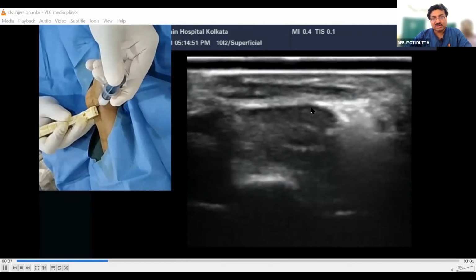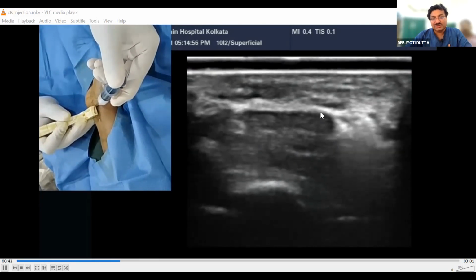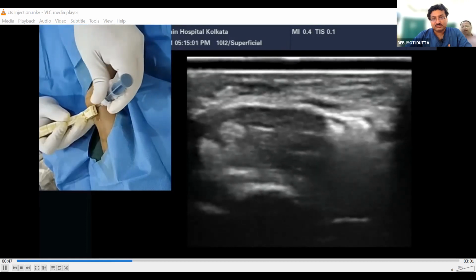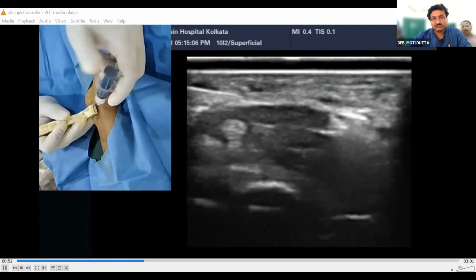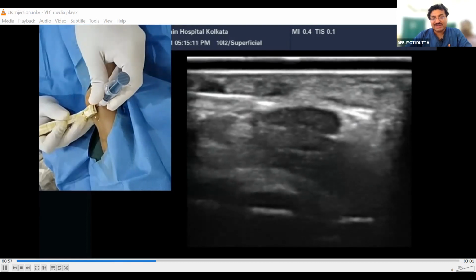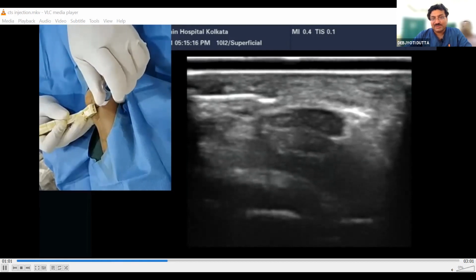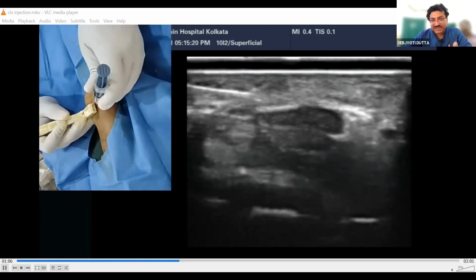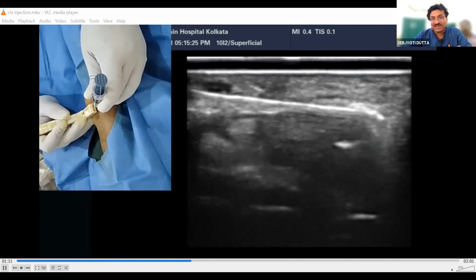Okay. First we are injecting. So this drug is moving up and down as well. And remember, don't push here. The patient is very stiff in this area. They were not able to enter the interface properly, so there is some pain. So I'm injecting slowly, doing the hydrodissection and then injecting. Now we are going to the proper interface.